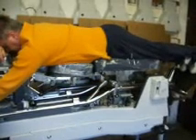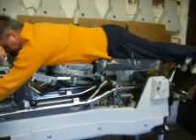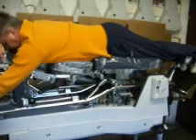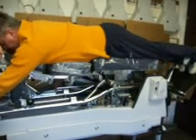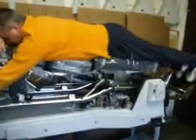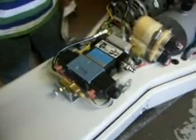Now we'll complete the cycle by bringing the patient back up. In this case, the VertiLift mode setting remains at the factory setting. And what we'll see in this case is that we'll complete the cycle in a normal manner. Table's gone down, it's made a good transition, and it's also moving back up to the stop point. So in that cycle, we've seen how we can affect the setting of Hylo mode on the valve pack without upsetting the setting on the VertiLift mode, and visually we can identify what the effect is on the cycle.